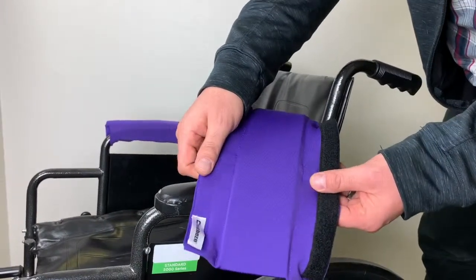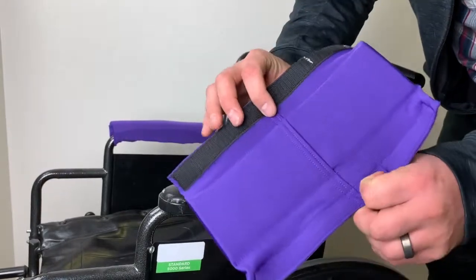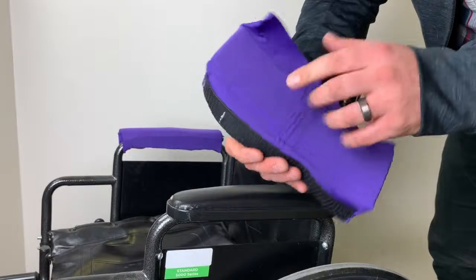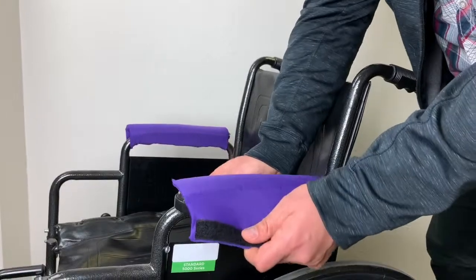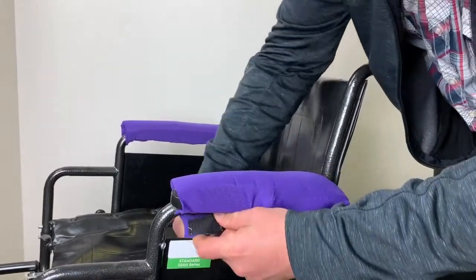The wheelchair padded cover has 10-inch velcro on either side for simple securing. What you want to do is make sure the hook starts on the inside so you wrap it around and it will not get in your way. Simply stretch it over the existing armrest cover and secure at the bottom. And that's it.